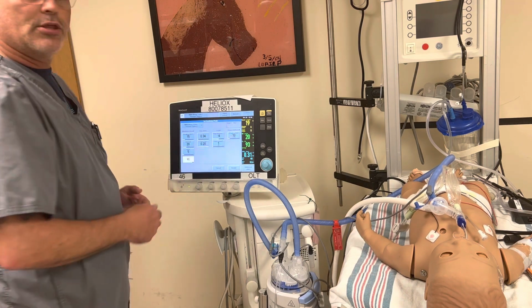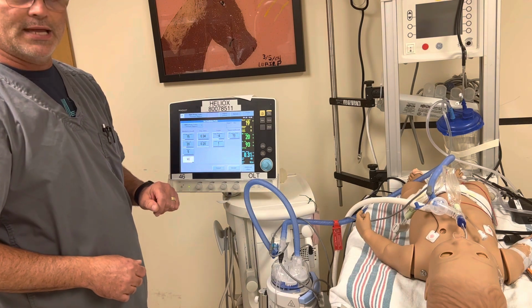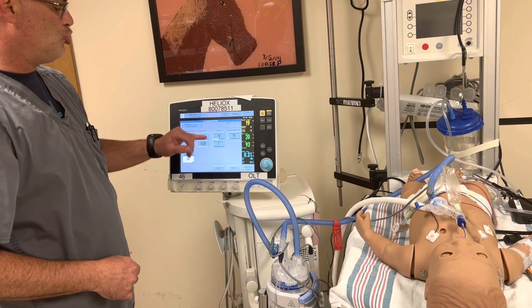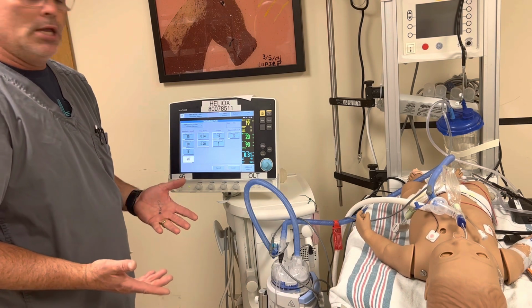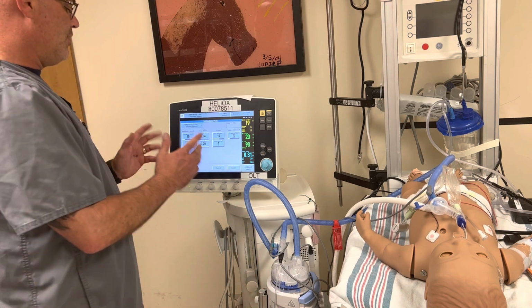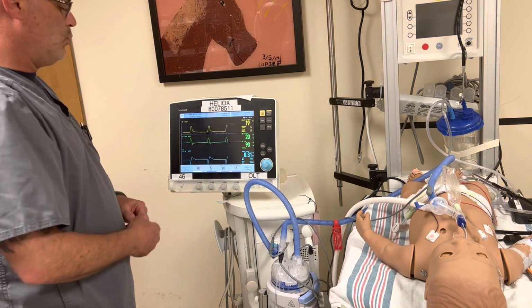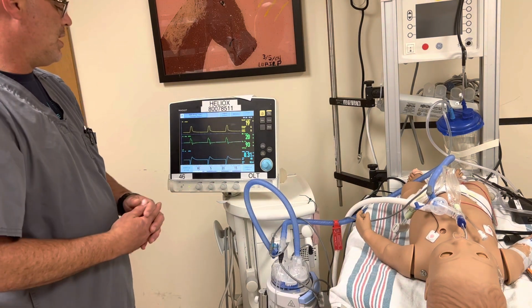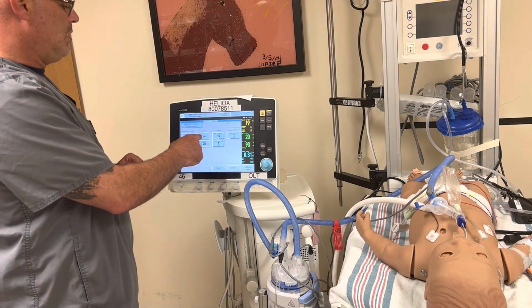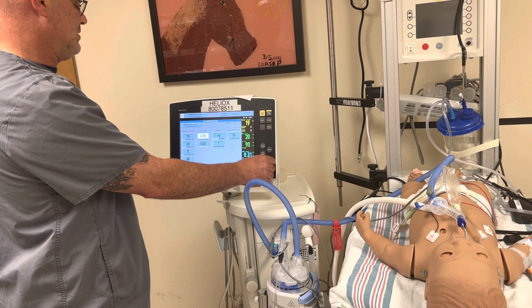And we have all these other settings still that need to be set without an order. We have the pressure support that has an order tied to it and it's set at 10. The I time, the rise time, the trigger, and the percent cycle. These are all things that greatly affect the ventilatory status that need to be set. So the first thing we're going to do is we're going to start the vent with those ordered settings plugged in. We're going to look at our patient. We're going to set this I time to get a 1:3 I:E ratio with that ordered set, just as a guess.